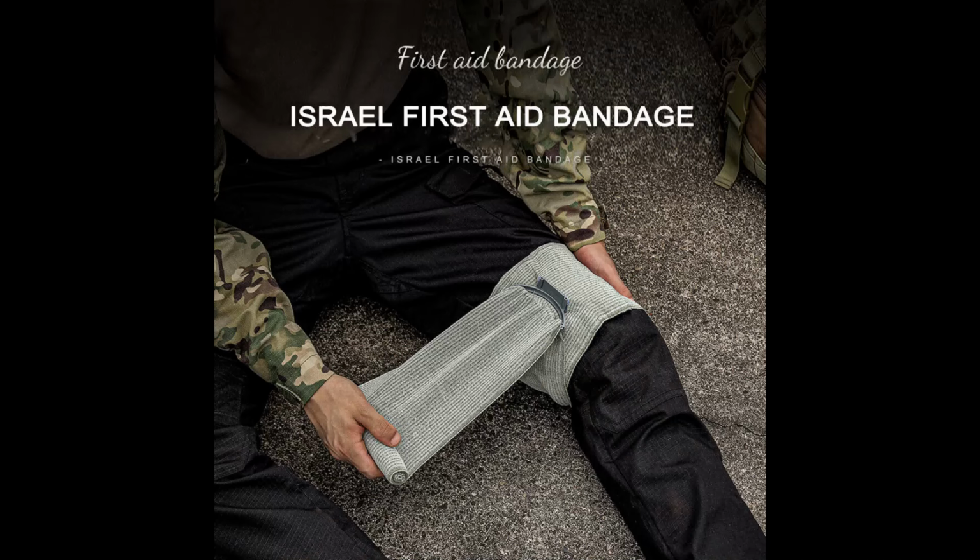Well, the only one I know about is the Israeli bandage, and that's quite complicated, and it isn't very thick gauze, and this is much thicker. Now, you wouldn't be able to get as much pressure on it, but you can put enough pressure on this in the field to slow the bleeding significantly. Yeah, it's not bad. So, Kitty, have another look in this side, see what we get. I've removed the shell bandages only. Aha, what's that? It's field medical.